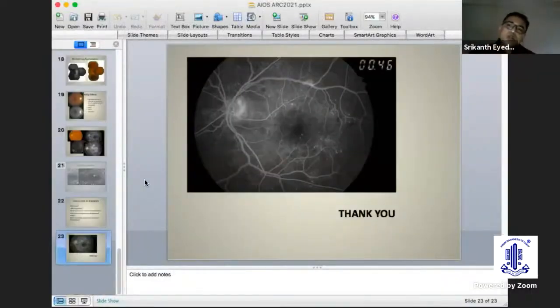In diabetic retinopathy, now that we are migrating more towards OCT-based treatment, especially for macular edema, and basing more of our diagnosis of PDR on fundus photos and clinical examination, there are certain situations where I still do a baseline fluorescein angiogram: in a patient where I can't really correlate the extent of vision loss and the extent of macular changes.